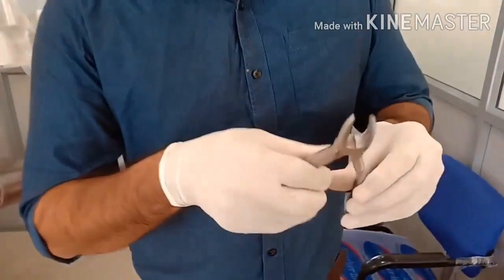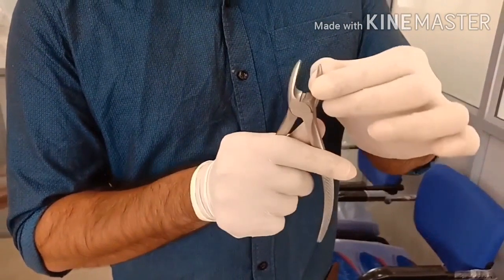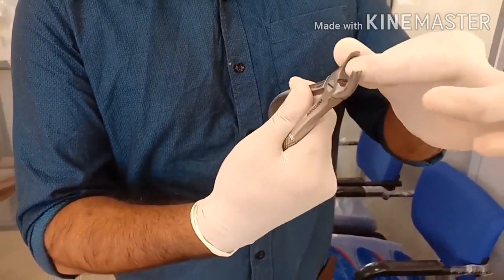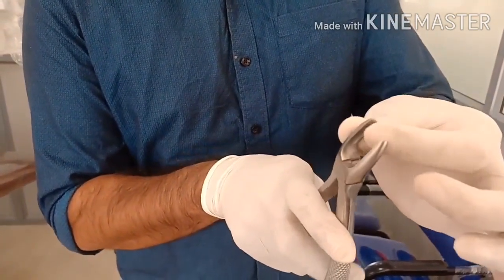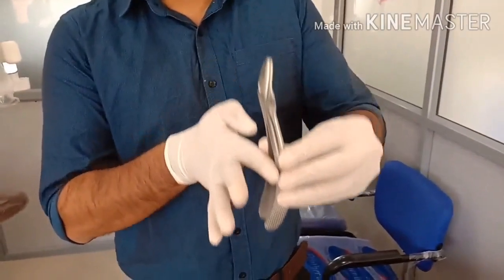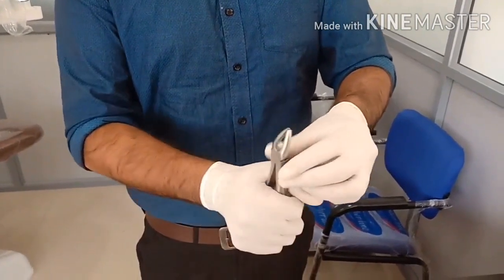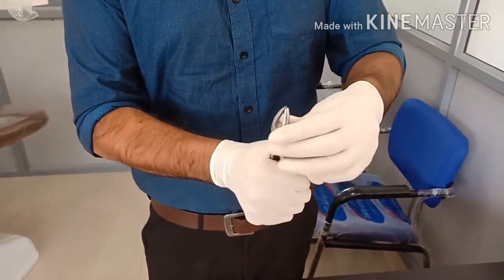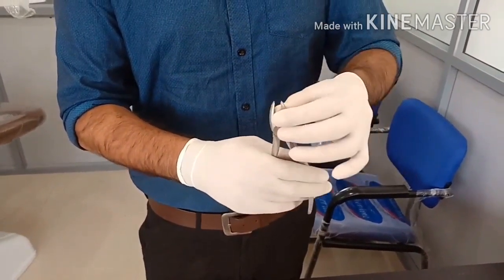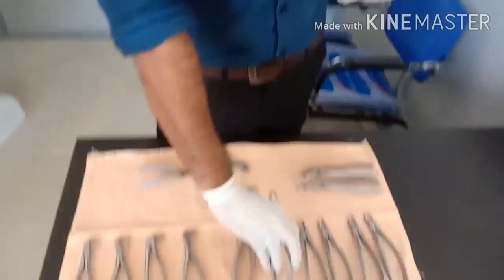This is a premolar forceps. There is no right and left premolar forceps — it is a common forceps for both sides. The serrations are almost the same on both beaks. There is a concavity on the handle going convex towards the beak, which aids in grip. It is commonly used for both right and left premolar extraction.